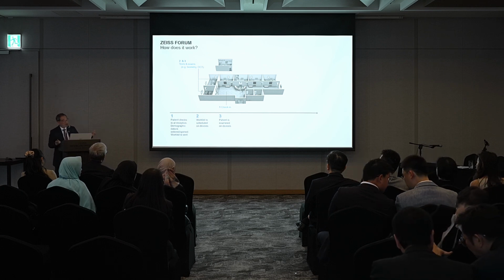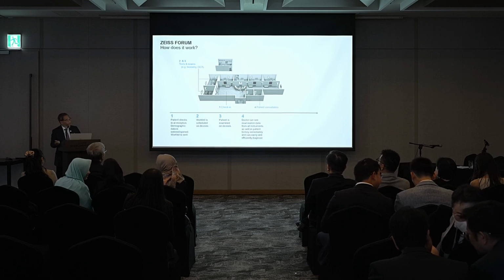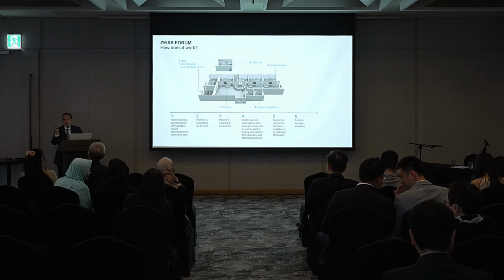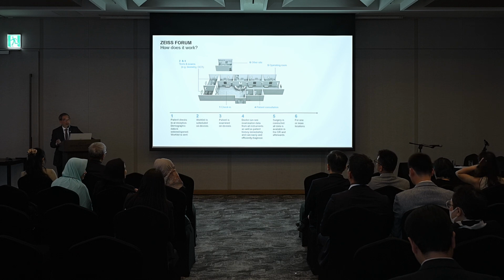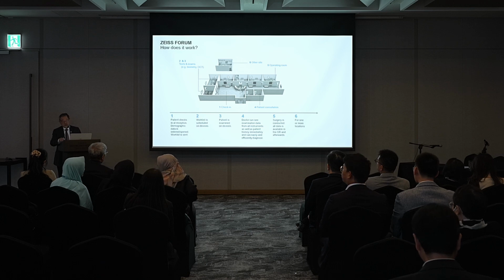Of course, with surgery, that's really for cataract. I think another advantage is off-site. I think this morning you heard from Smita the advantages of having the Forum open images across your locations. Right? So many of us practice in different places. We don't need to repeat those tests in those individual locations.